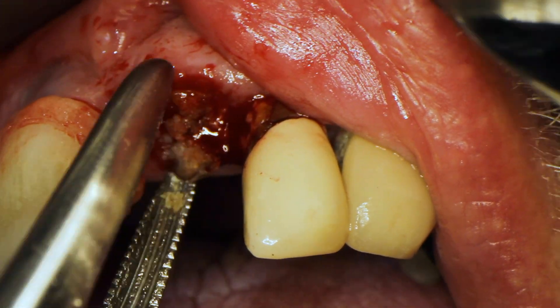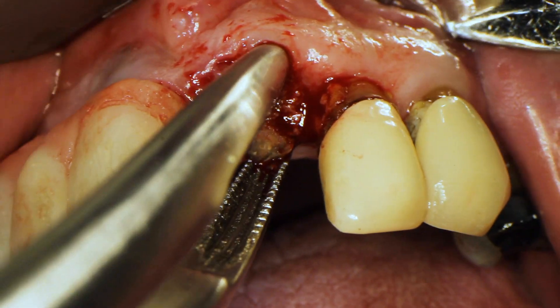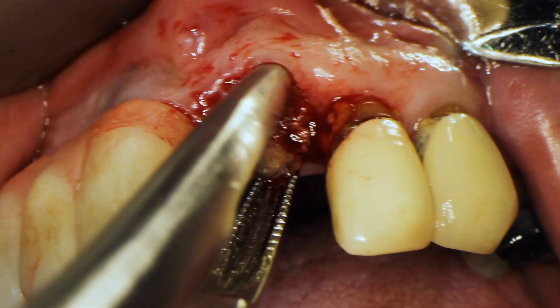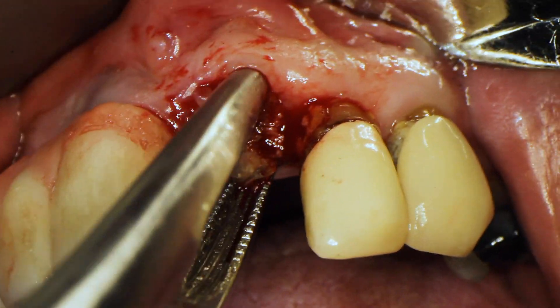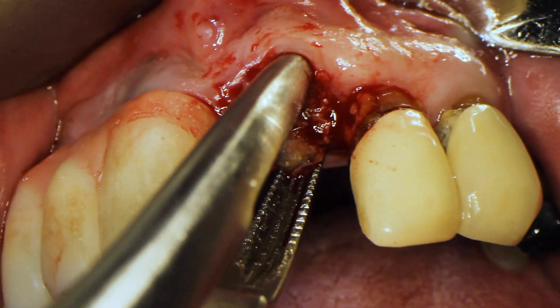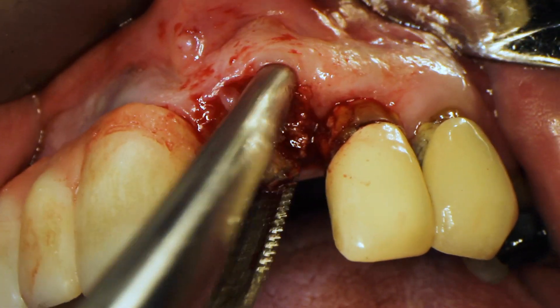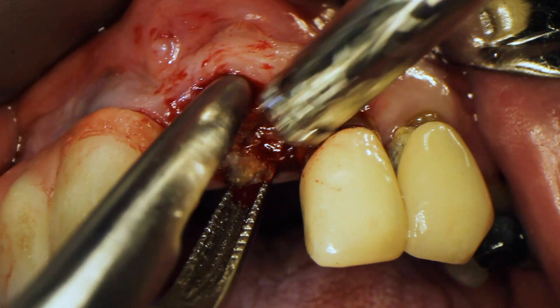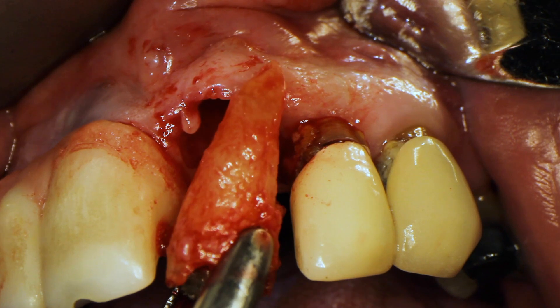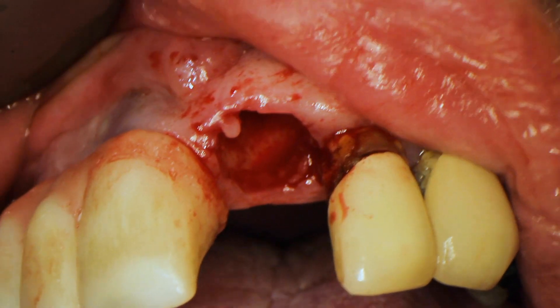I'm grabbing it with this root tip forcep and just wiggling it until it comes out. If you don't have a set of root tip forceps, I really like these — I got them on salvin.com. Having forceps with really small tips helps a ton with extracting root tips once they're loose. The tooth is out now.